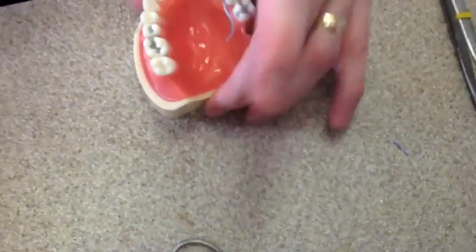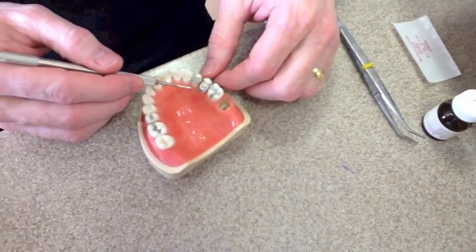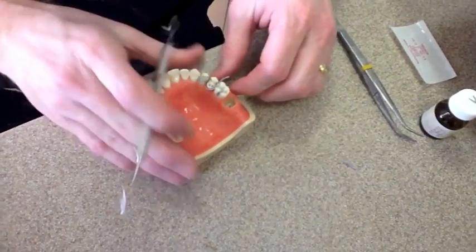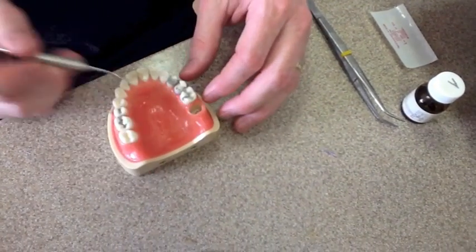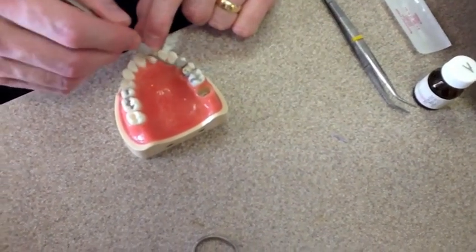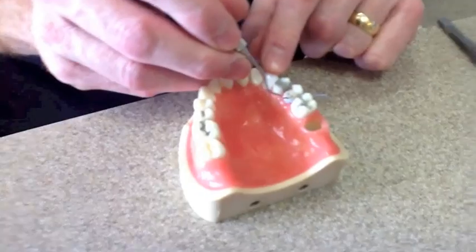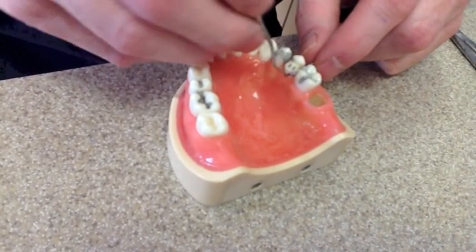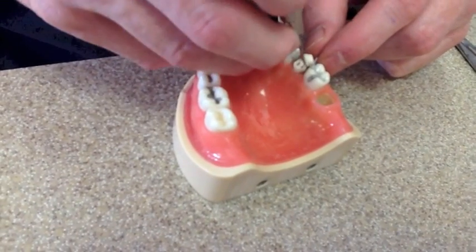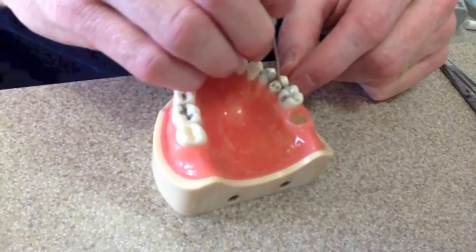Okay, I'll turn it this way so the camera guys can see. I'm going to wrap it around again. And we're going to come that way. And if you notice, I have one finger on the end, and I do that in the mouth. I'll pull a lot. If I can't, then I just kind of push, or I'll push it with my finger that way. I like it to kind of wrap. And I'm pushing in. I'm going to change angles, push it in. I'm going to pull it tighter, push it. Push it because I'm at the contact. Push it. Okay. And I push it.